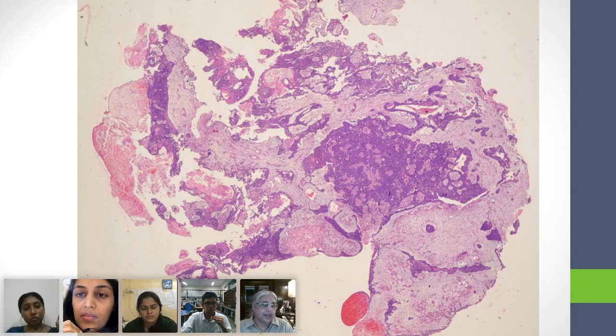You really think that that's a gland? You have something in the lung, a space lined by flattened epithelium, which we call an alveolus. Is that a gland? No, ma'am. So then what is a gland? It has to have a function of secretion. So the cells of that structure, which has a central lumen, must have a secretory function. That is essentially what a gland is.